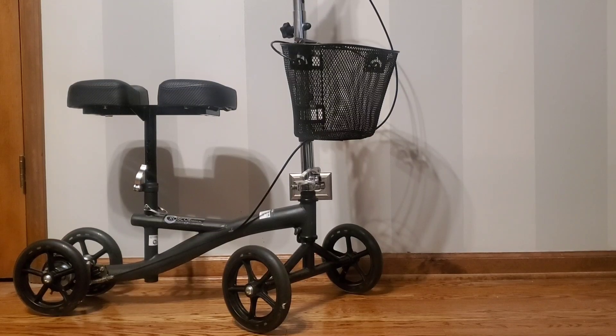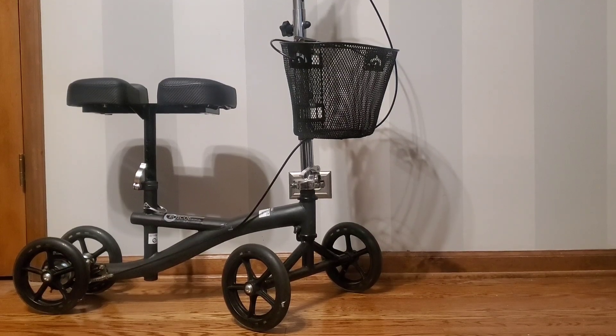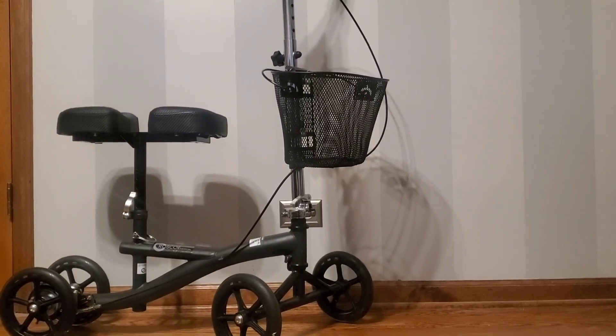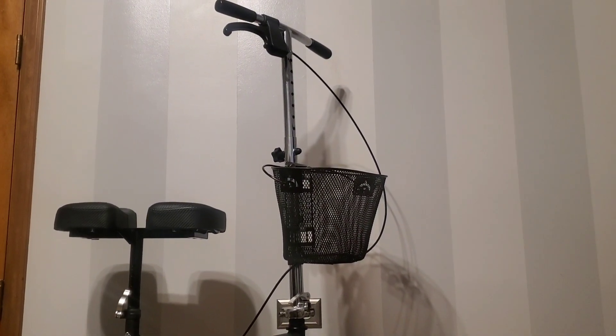My husband broke his ankle and we're trying to find new options to help him get around while he's healing. He tried to be a big burly man by telling me he is fine with just crutches, but when I came home with this knee scooter, he took to it and loved it.